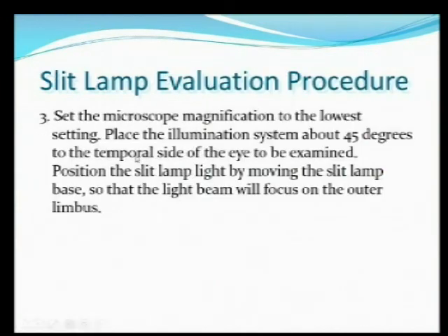We want to start with the lowest magnification in most cases. In some cases, there might be a really low magnification, like a 10, which is probably a little too low, but most are 16, 25, and 40. If you happen to have a 10, 16, and 25, use the 16 as your low magnification. You might think, why don't we crank it right up? The problem is that the higher the magnification, the smaller your field of view, and the easier it is to get lost when you're doing the exam. So start out with a lower magnification, you get a wider field of view, and if you see something that looks a little out of the ordinary, you can always crank it up.